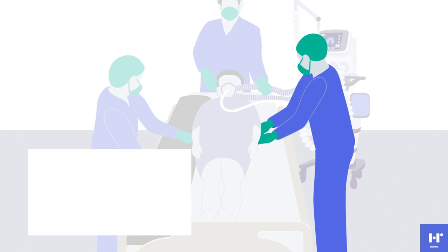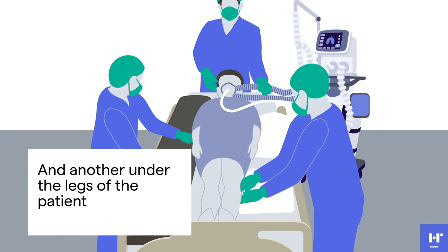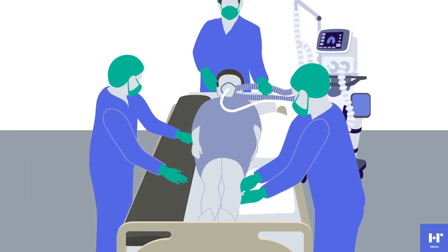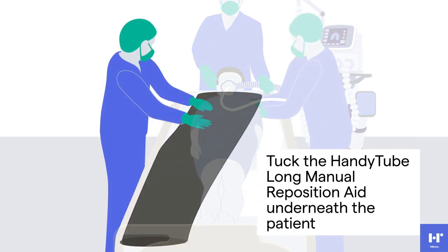The care team member on the left side of the patient will tuck one pillow underneath the left hip area and another pillow underneath the lower legs of the patient. Tuck the patient's left arm underneath the left buttock to manage the arm during the turn, being careful to manage lines and prevent displacement.